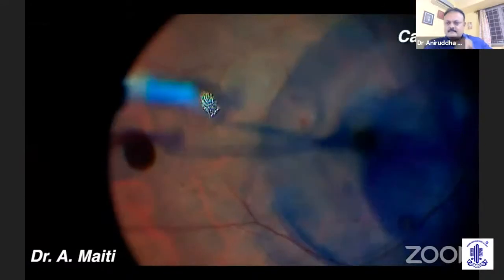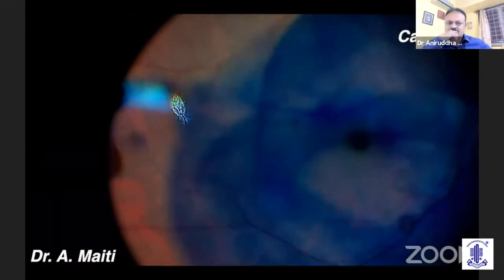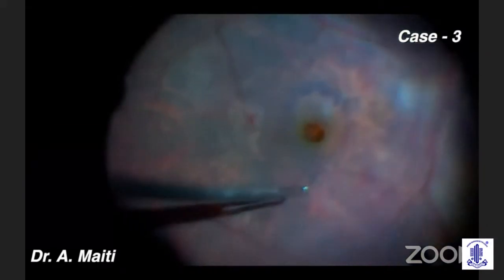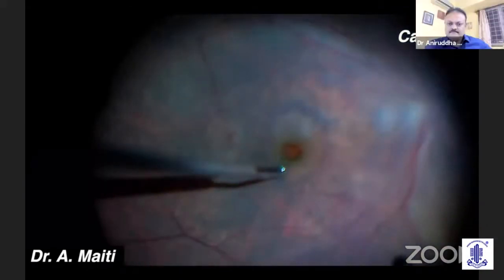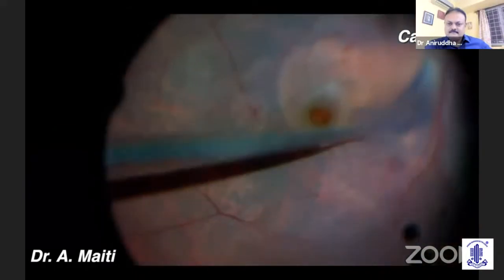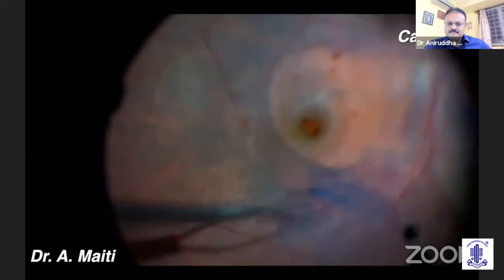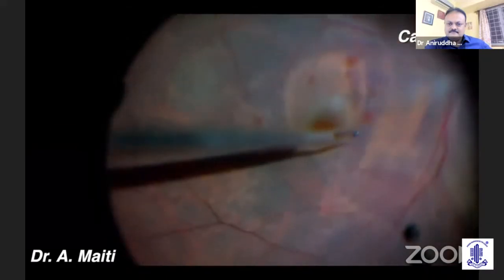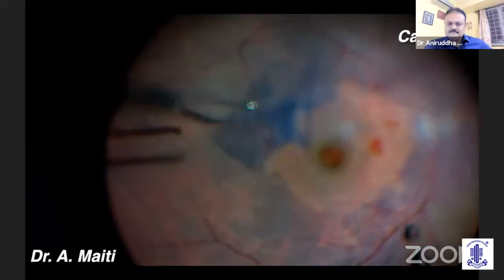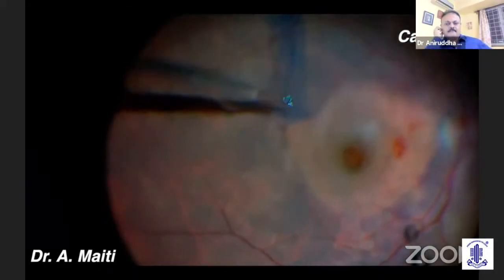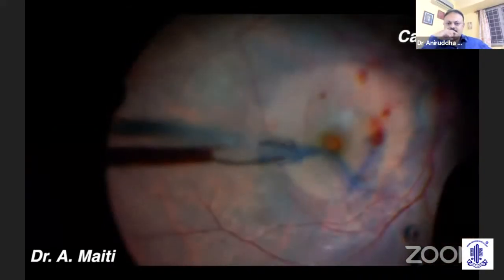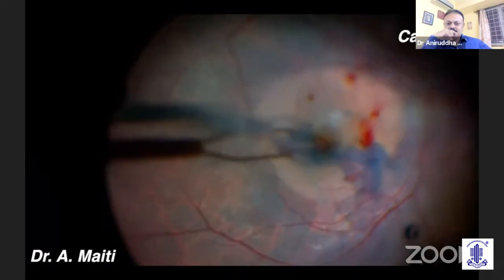The third case was a case of a simple macular hole. After staining with BBG dye, ILM peeling was started. After peeling a part of the ILM, I realized that the hole might not close with conventional peeling. So I tried to do a free flap technique and got a nice free flap, which I tucked inside the hole.